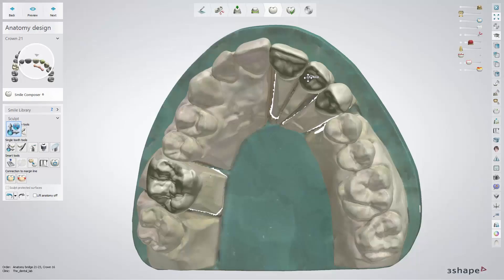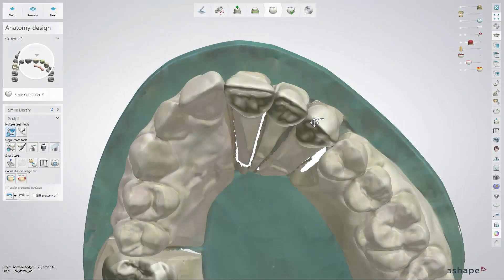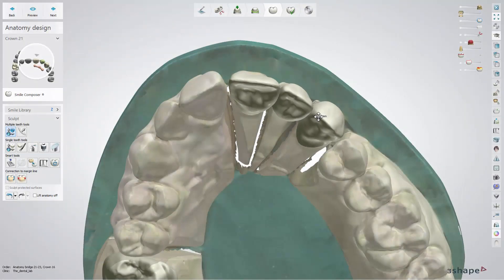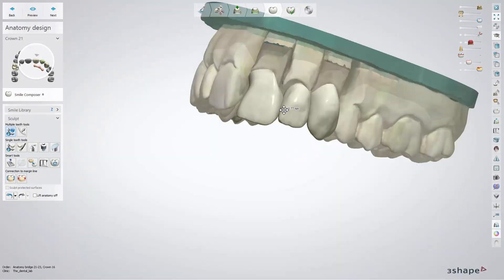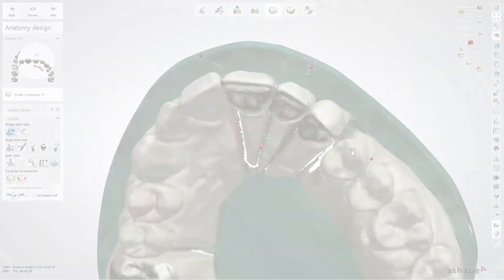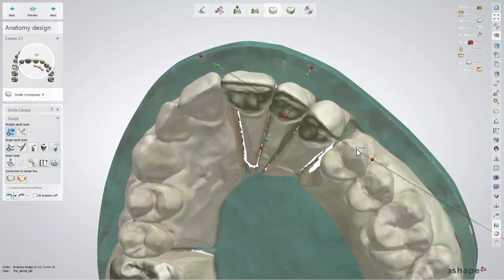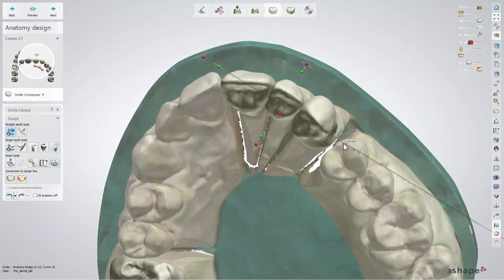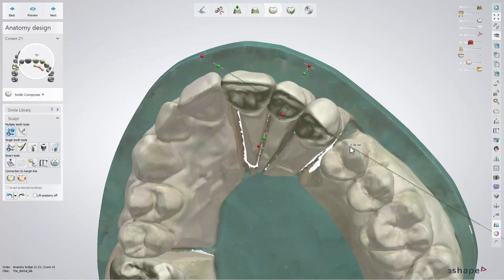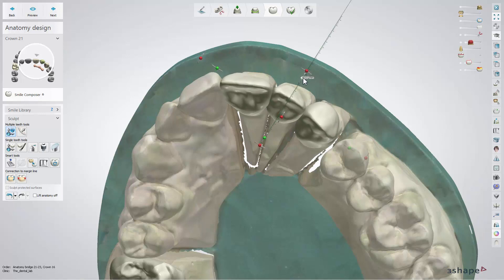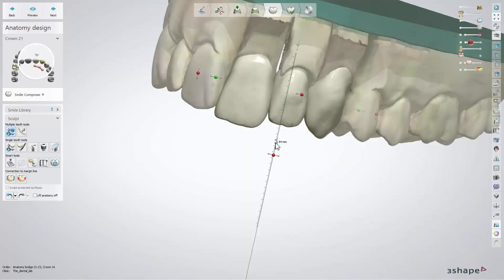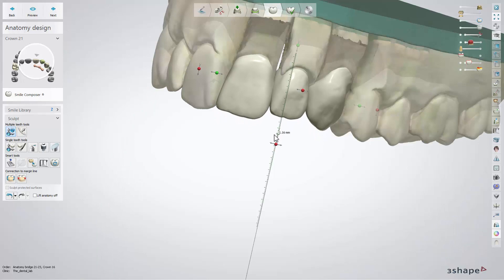The Global Transformations tool can be used for multiple teeth restorations and allows you to move, scale, and rotate all teeth in a restoration. To move your restoration, click on any point of the tooth and drag it sideways. Drag the green points to change the shape of a whole restoration by moving it sideways, back and forth, or up and down, depending on the view.